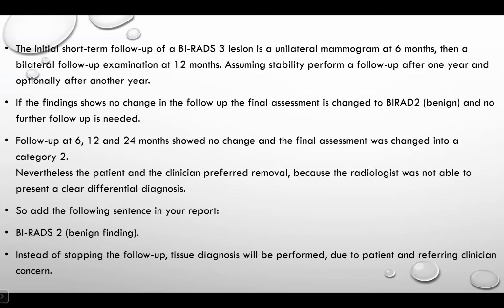category 2. Nevertheless, the patient and the clinician preferred removal because the radiologist was not able to present a clear differential diagnosis, so although it was a BI-RADS 2 finding, instead of stopping follow-up, the tissue diagnosis was performed due to the patient and referring clinician concern.